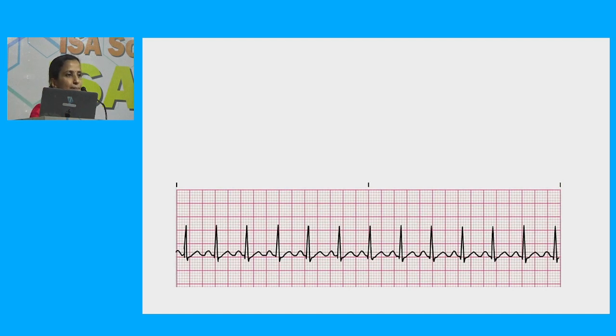It's a sinus rhythm because the QRS complex is followed by a P wave. Yes. The RR intervals are equal, and there is a narrow QRS complex, normal QRS complexes. Okay. You said there are P waves, each P is followed by QRS.